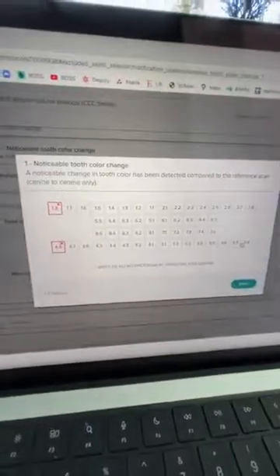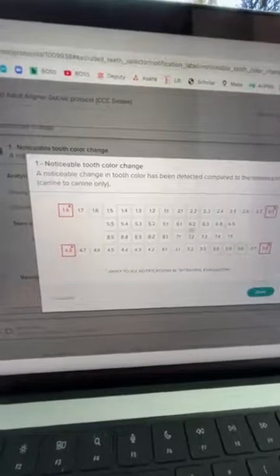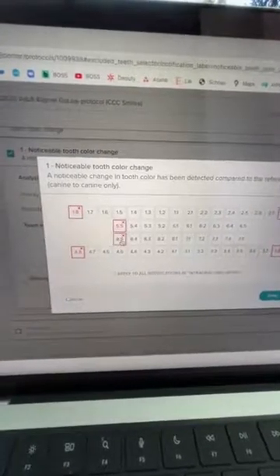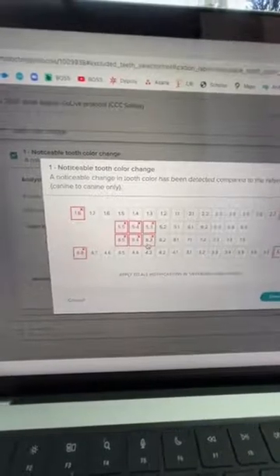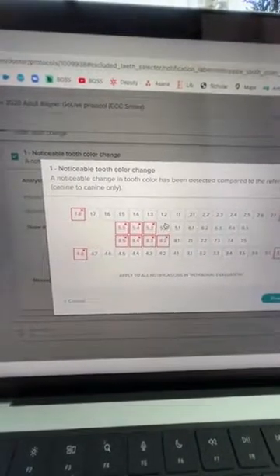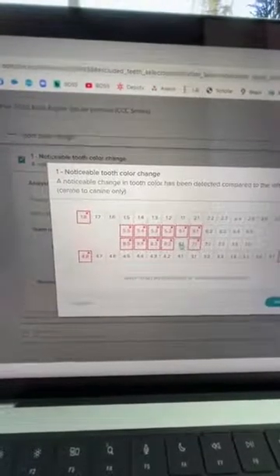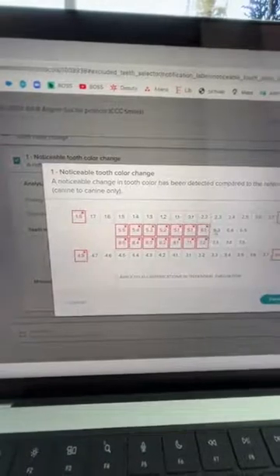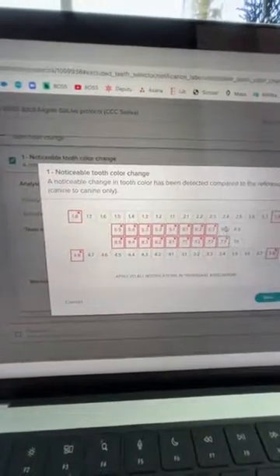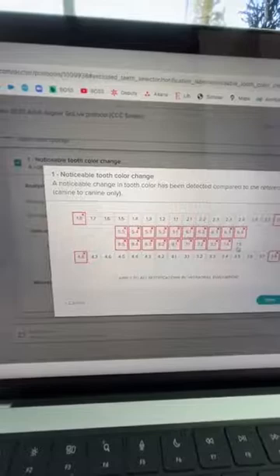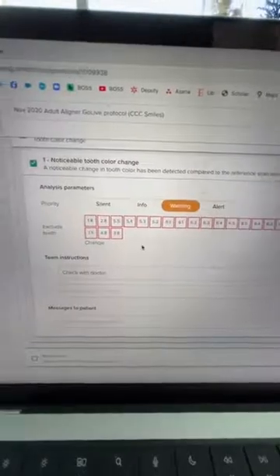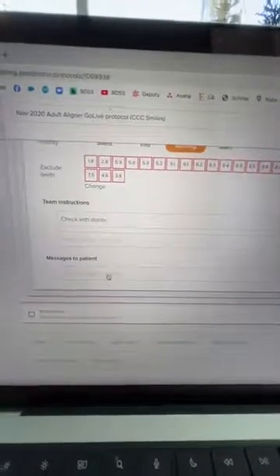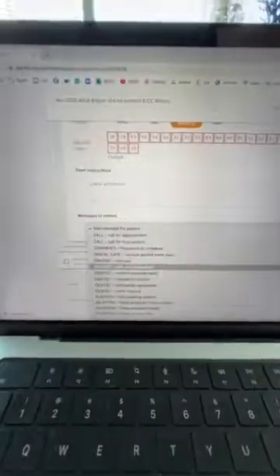I prefer orange alert and you can exclude teeth. You can say I don't care if it's the 18, 28 - I don't want to be notified of a color change of third molars. Or I don't want to be notified of color change in primary teeth if the patient has primary teeth and they're going to exfoliate. I'm going to say don't worry about primary teeth color change, I am not assessing that or evaluating that. I only want permanent teeth and I don't want third molars. Please don't track color change on those excluded teeth.